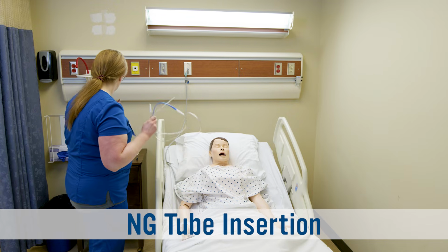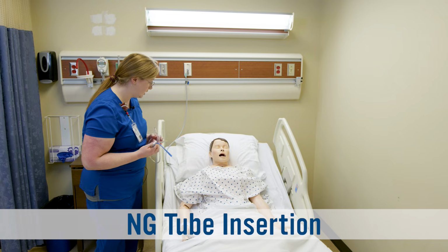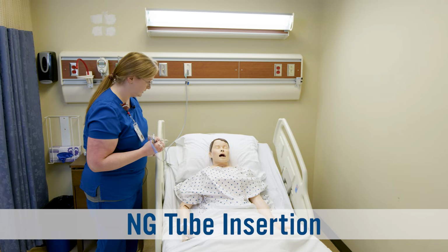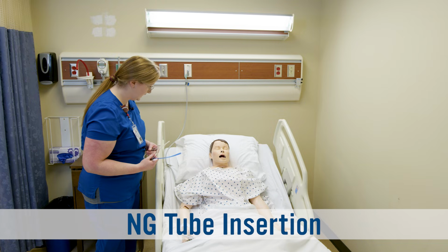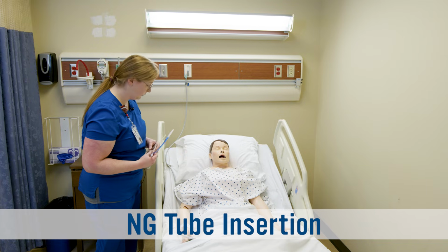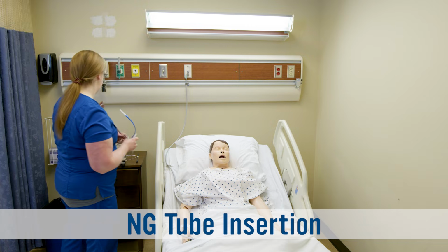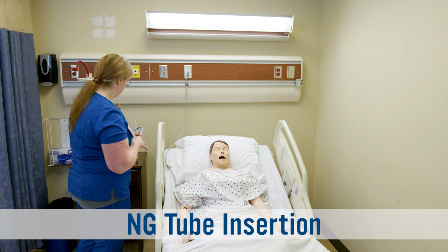Do you have any history of any facial trauma or nasal trauma or brain surgery or deviated septum? No? Okay. Do you have any allergies to any medications, lubricant, gloves, latex? No? Okay. All right. Well, I'm going to go ahead and do hand hygiene, put my gloves on, and we'll go ahead and get started with this.